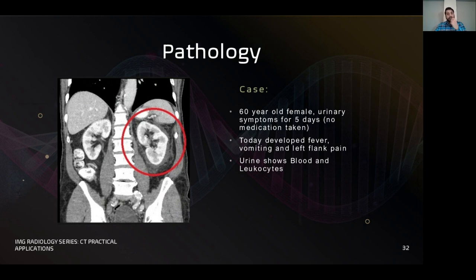Nephritis, okay. We refer to this as pyelonephritis. This is a kidney infection, essentially, all right? So you can see here, there's a bit of what I called before fat stranding. So the tissue around it looks a bit inflamed and infected, okay? And the kidney looks slightly larger than normal as well. And this is what I mean by the different types of tissue you can see. Yep, pyelonephritis, Edgar. Yep, you're correct.